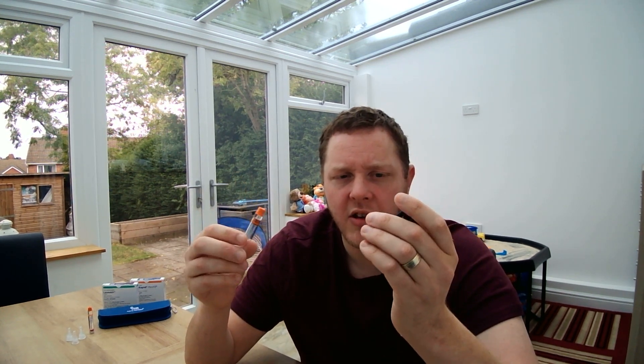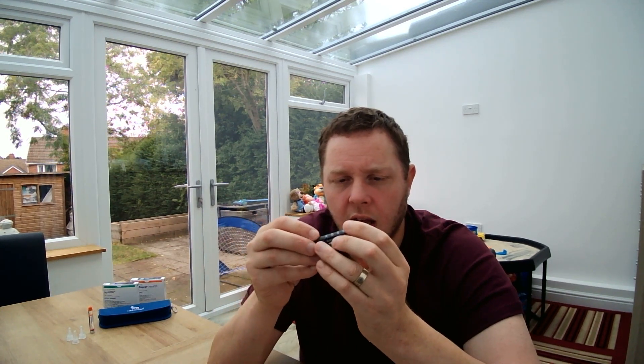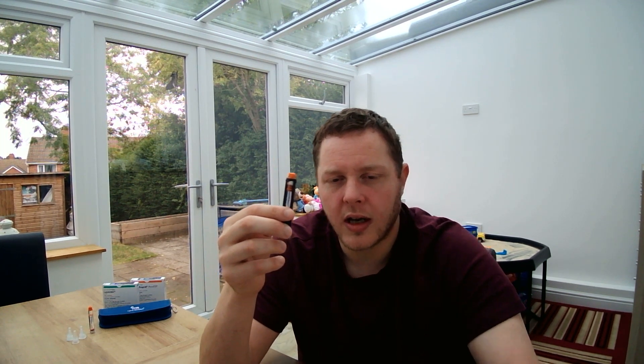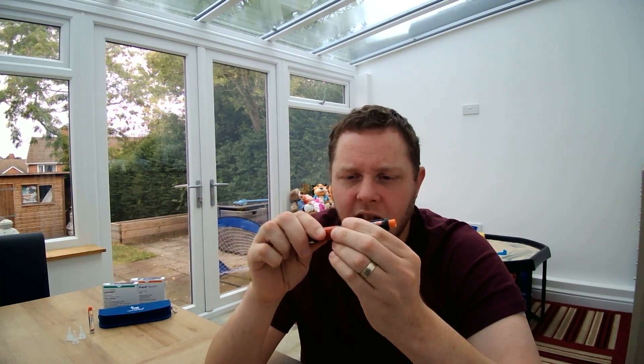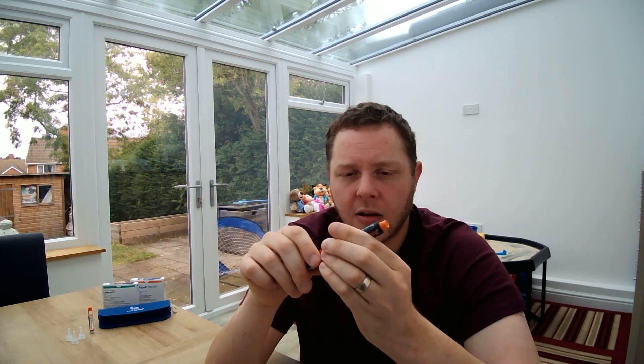Let's connect the components together and then do an air shot. You've got your cartridge and your cartridge holder, and you're simply going to connect the cartridge into the cartridge holder, sliding it all the way down until the threaded end is at the bottom — that's where the needle will connect later on. You've also got your pen with the piston, and we're going to connect that into the cartridge holder and click it — you'll hear a click sound. As simple as that.